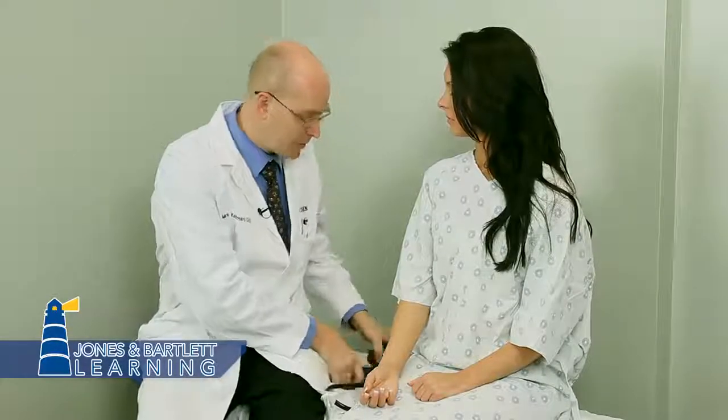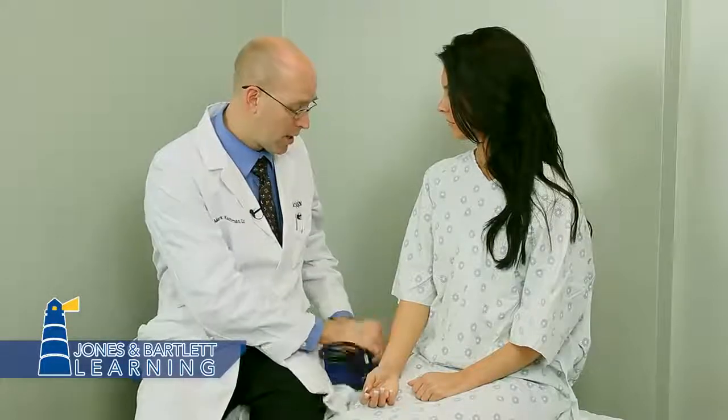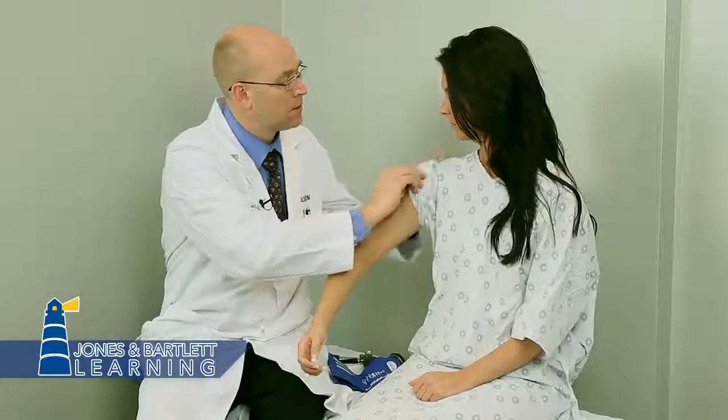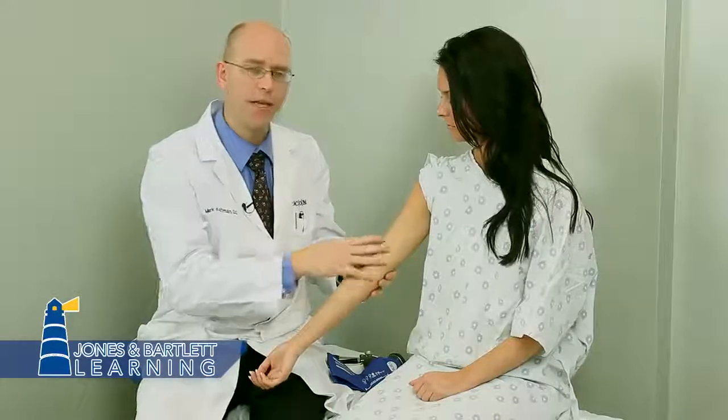So the blood pressure cuff is very important, and the first thing that you want to do is make sure you have the right size for the patient's arm. So you ask the patient to expose the arm, and then you have them roll. And don't be afraid to let the patient help you.